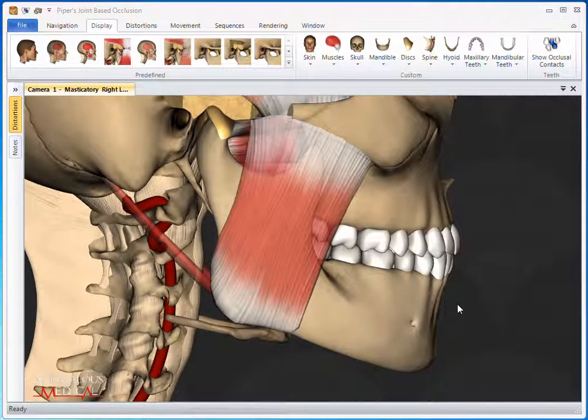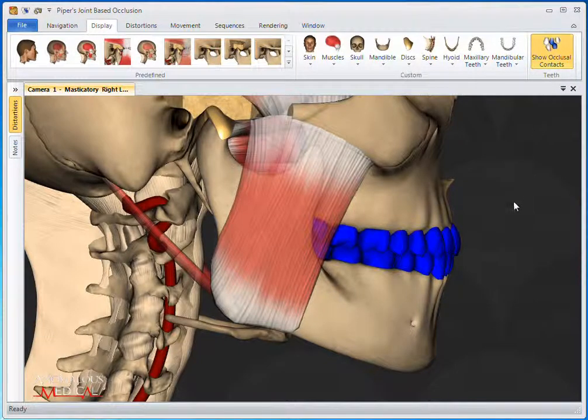This video will highlight the Show Occlusal Contacts feature of Piper's Joint Based Occlusion. The Show Occlusal Contacts button will highlight the teeth in blue that are currently touching each other. It can be turned on by clicking the Show Occlusal Contacts button.